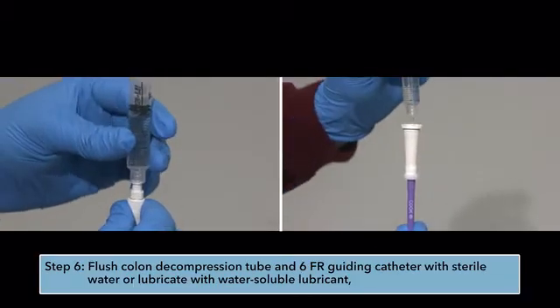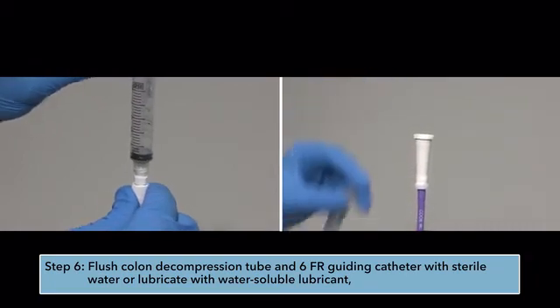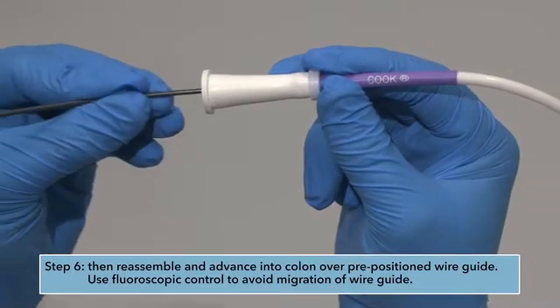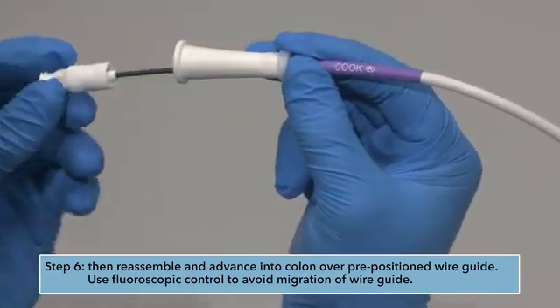Step 6: Flush the colon decompression tube and 6-French guiding catheter with sterile water, or lubricate with water-soluble lubricant. Then reassemble and advance into the colon over the pre-positioned wire guide. Use fluoroscopic control to avoid migration of the wire guide.